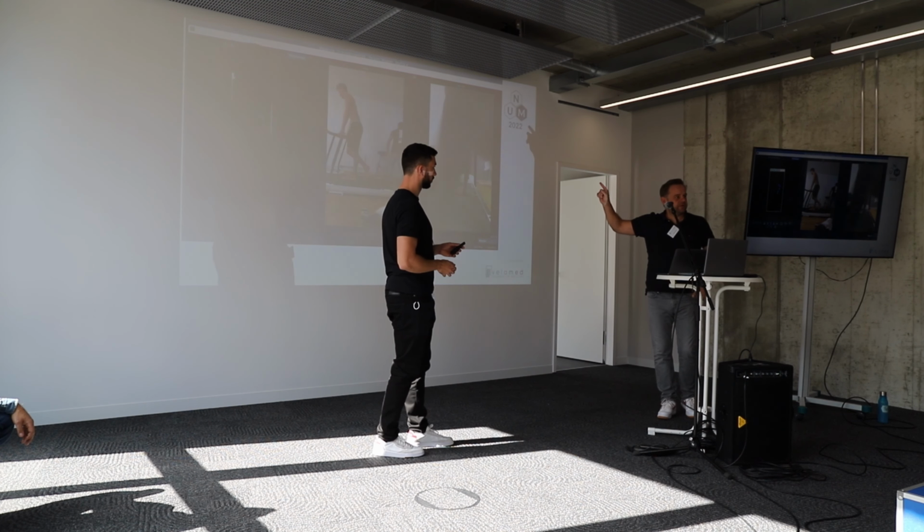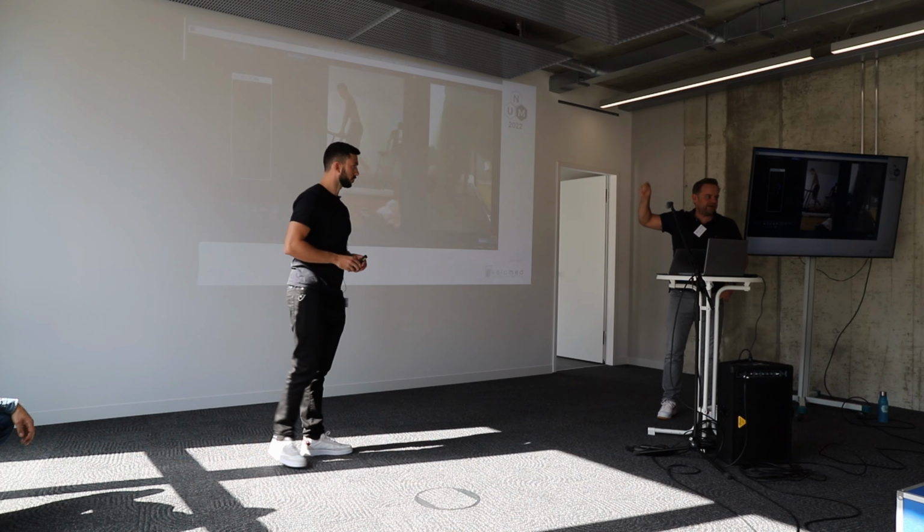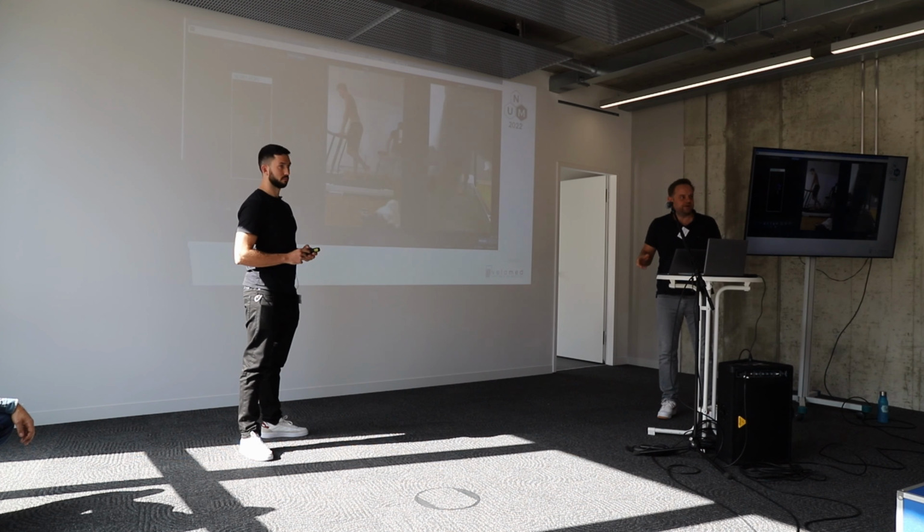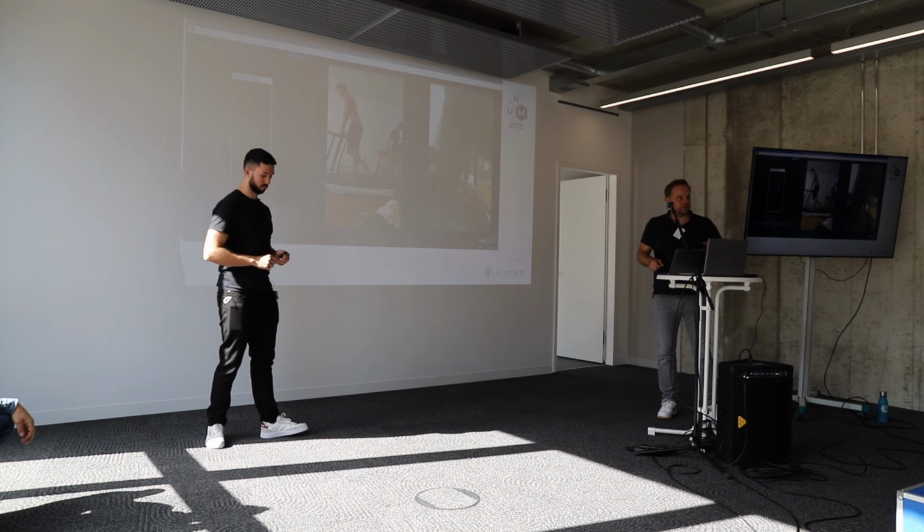I don't know if you could see when he was on his left foot, the injured foot, he had to grab the handle to feel safe. When he did it on the right side, he did not even use the handle, so he was totally insecure. And that feeling he had for 2 years, for the whole time.